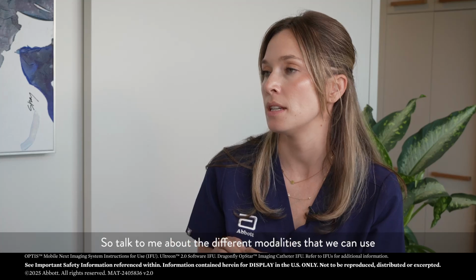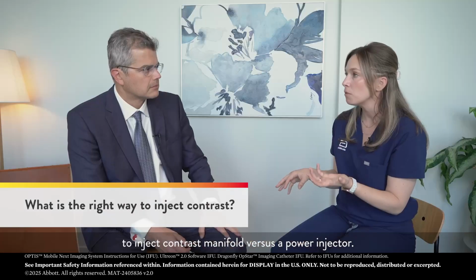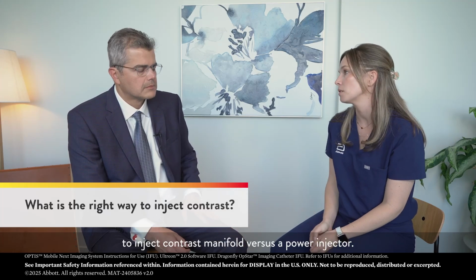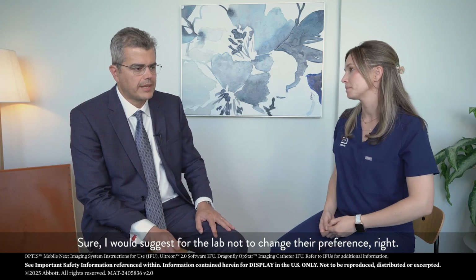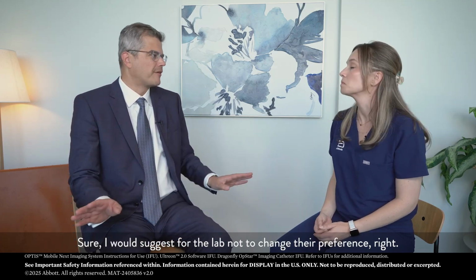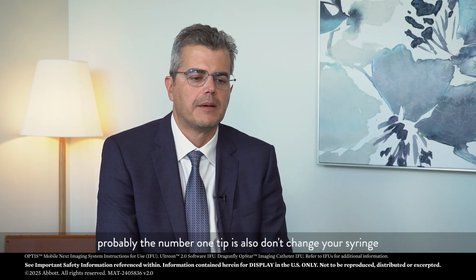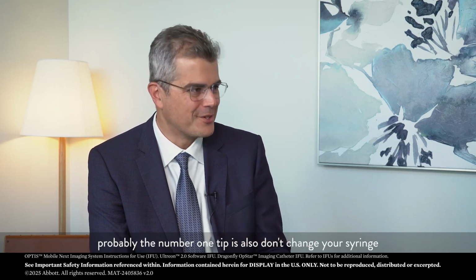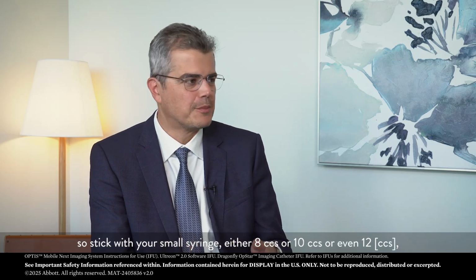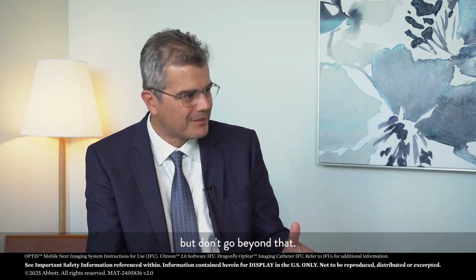So talk to me about the different modalities that we can use to inject contrast, manifold versus a power injector. Sure. I would suggest for the lab not to change their preference, right? So you can go either. So if you practice with manifold, probably the number one tip is also don't change your syringe. So stick with your small syringe, either 8 cc's or 10 cc's or even 12, but don't go beyond that. Mm-hmm.